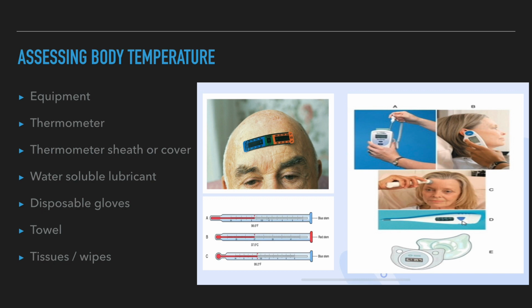6. Glass mercury thermometer. Although some homes still have glass thermometers, healthcare environments no longer use these devices because of the risks of mercury exposure to people and the environment should the thermometer break. Mercury exposure can cause respiratory irritation, gastrointestinal irritation, and renal damage. Prolonged exposure causes neurological impairment.